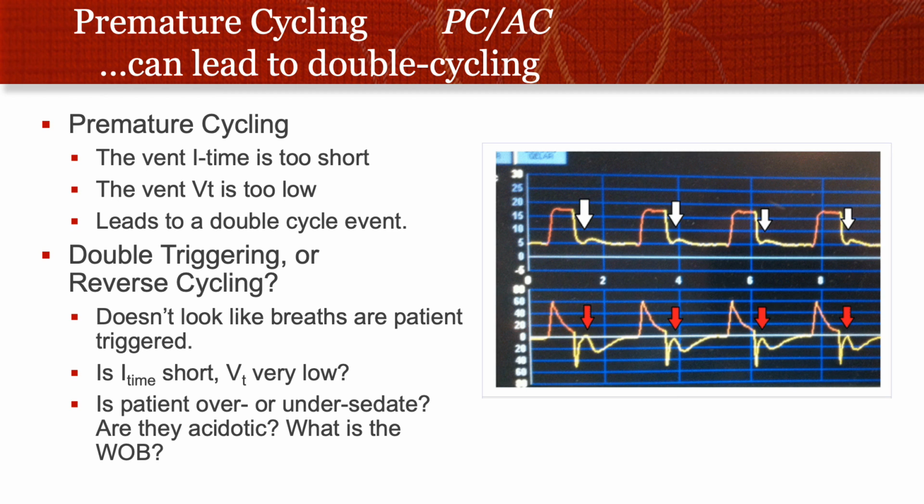When I look at this waveform, it's very hard for me to get an idea of whether they're double triggering or reverse cycling. It doesn't look like the breaths are patient triggered, but it's hard to tell sometimes. The I time, this isn't my vent, I don't know if it looks short or if the tidal volume is very low.